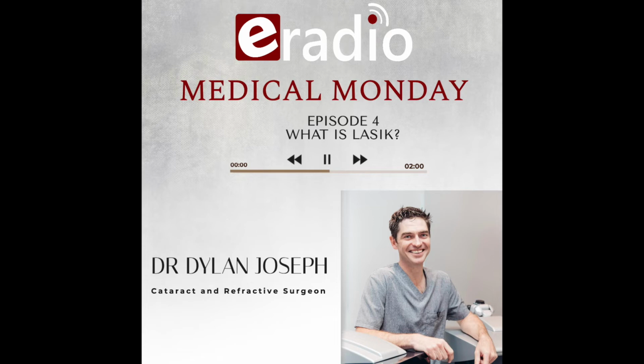So it's certainly come on in leaps and bounds, and as the technology evolves, so the nomograms evolve and tighten as well, meaning we collect all the post-operative data and input that into software nomograms, and every refractive surgeon that does large volumes of surgery watches their outcomes. So it's all about refining your outcomes and getting the nomogram tighter and tighter so that your results are better and better in the long run.